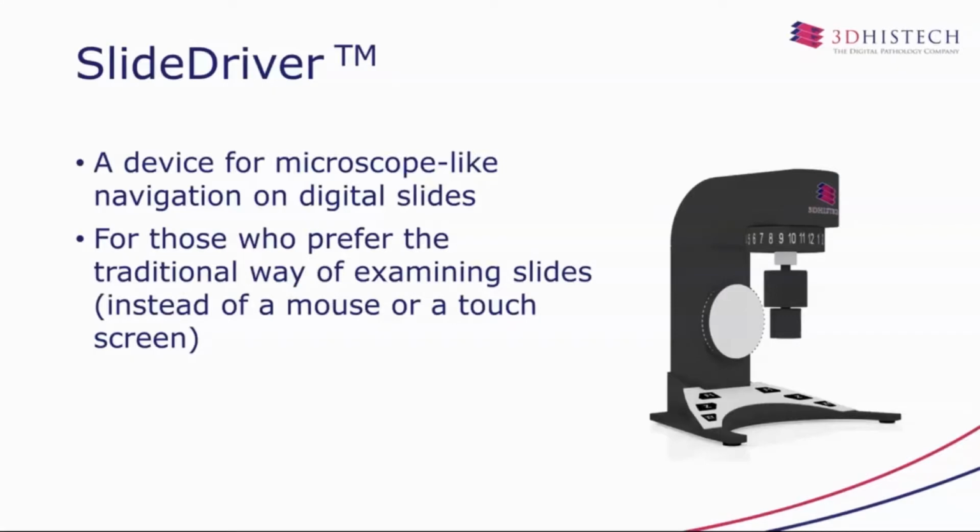The CaseViewer software is fully compatible with our slide driver. The slide driver is a device with microscope-like controls. We recommend it for users who prefer the traditional microscope controls instead of the mouse or instead of the touch screen for navigating on the digital slide.